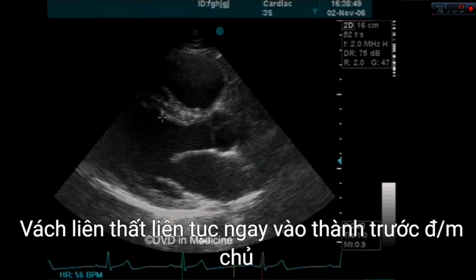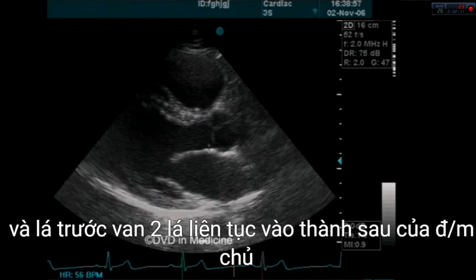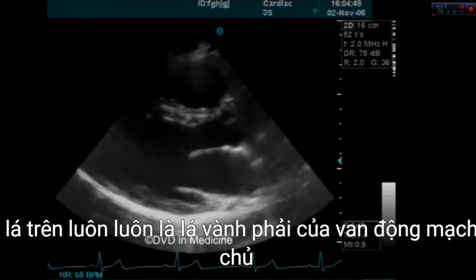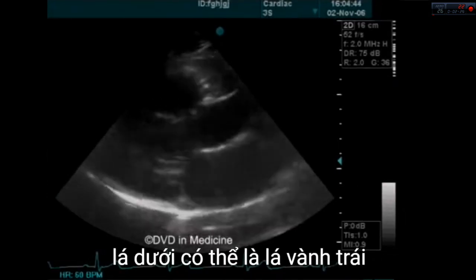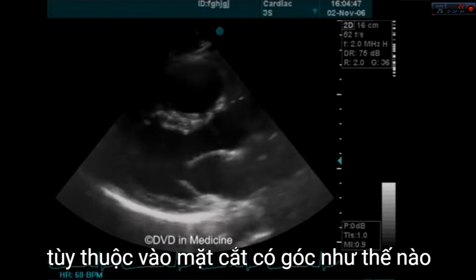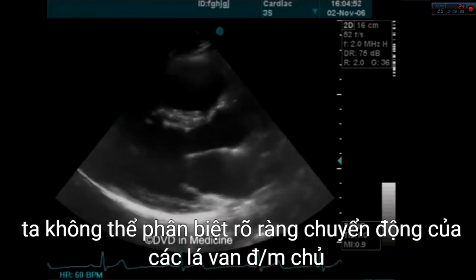The interventricular septum directly continues into the anterior aortic wall, and the anterior mitral valve leaflet continues into the posterior aortic wall. In the root of the aorta, one will see the motion of two aortic valve leaflets. The upper leaflet is always the right coronary leaflet of the aortic valve. The lower leaflet can be the left coronary or non-coronary leaflet of the aortic valve, depending on how the scanning plane has been angled. In most cases, one cannot clearly discern the motion of the aortic valve leaflets because they are very thin.